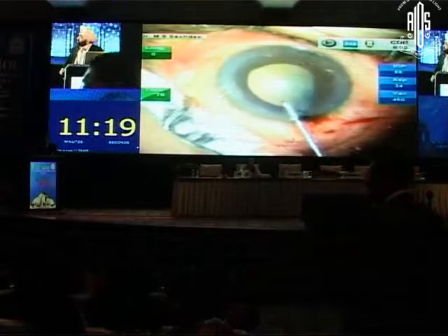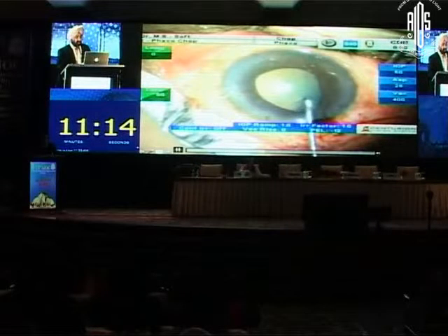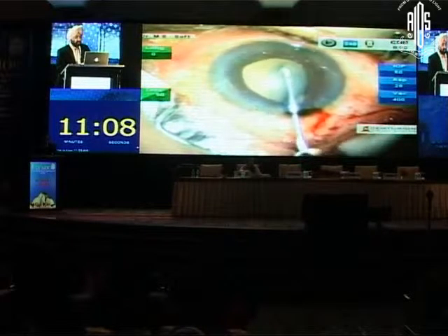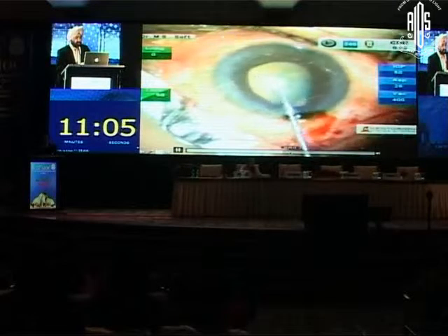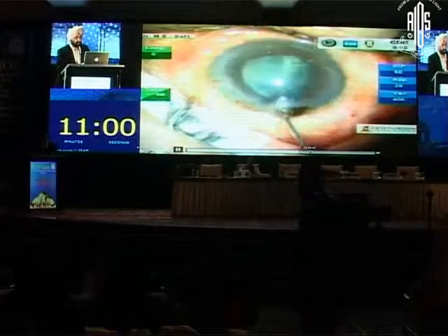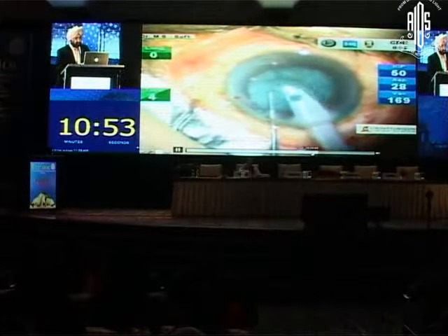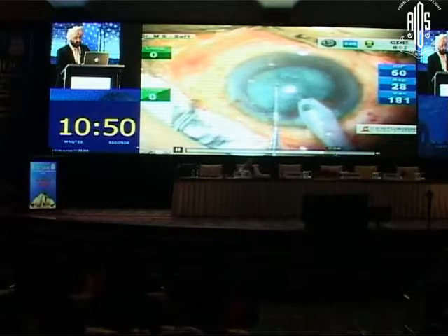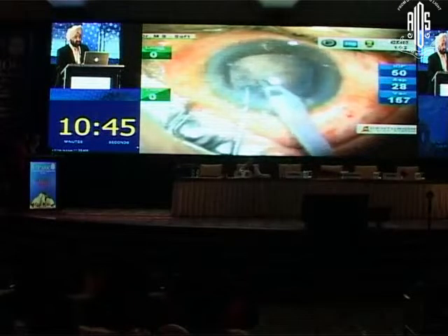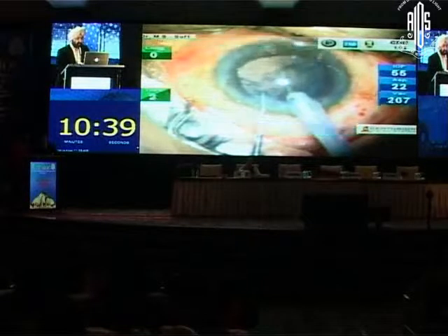You go ahead, you do a capsulotomy, which takes a little while, and after doing this, we can go ahead, and the phacoemulsification really goes on, but you have to take all the precautions in phacoemulsification so that you don't end up with a problem. Look at that iris coming out again and again, and you can see that we're doing a hydrodissection in this particular case, and there you do the phacoemulsification, and things get out reasonably well in spite of the shallow anterior chamber. Now, epinucleus plate coming out, we go ahead and we finish this particular case.